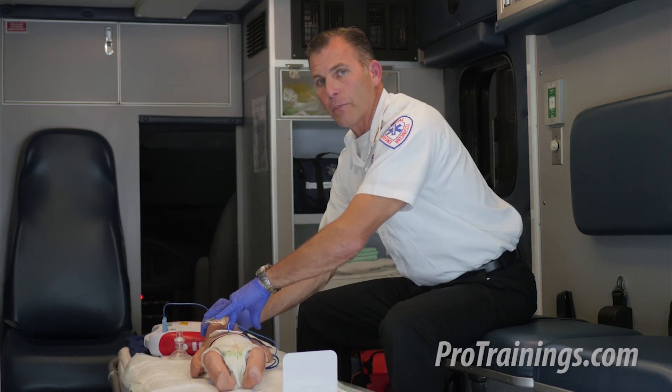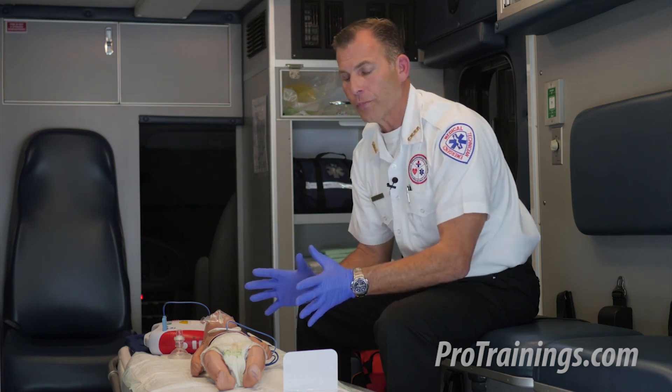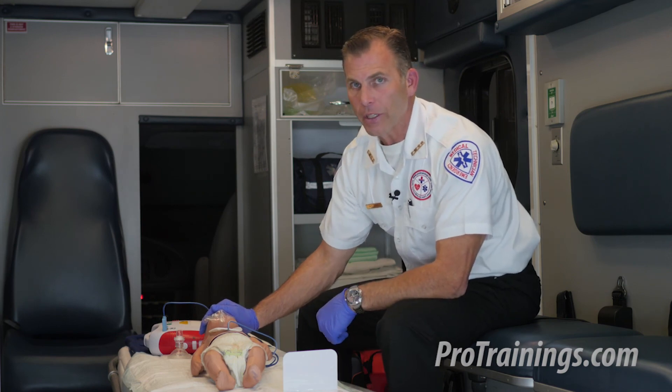I'm going to go right back into my CPR compressions and continue to do this until EMS arrives, the rest of the help comes, and we find definitive treatment for this infant, or until the baby starts to respond and breathe normally.